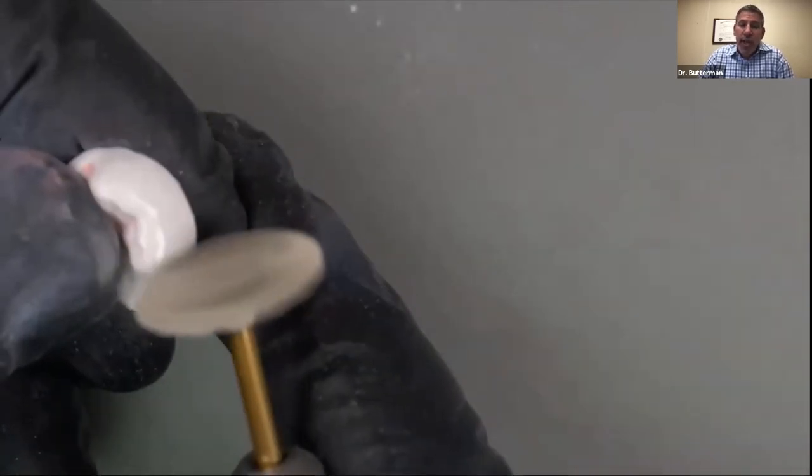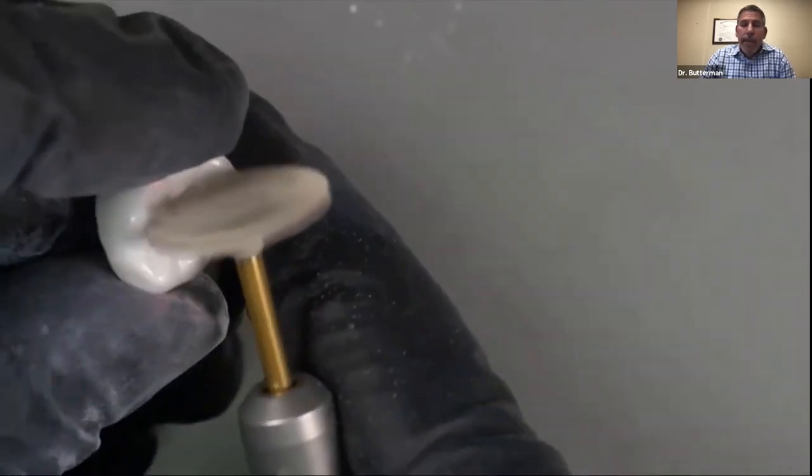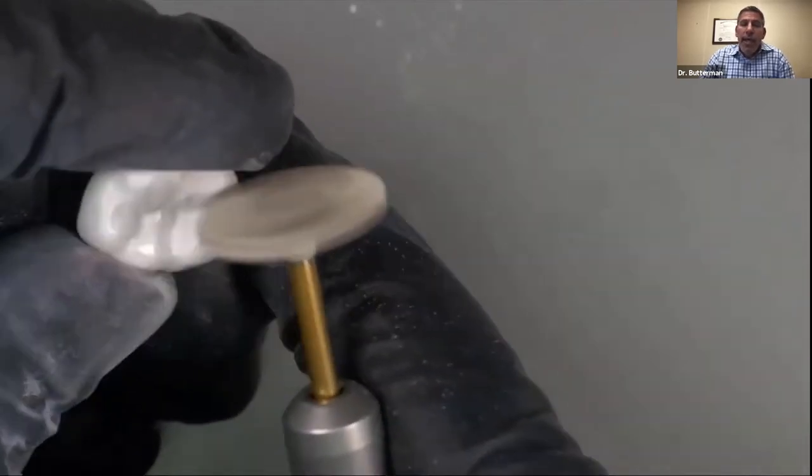We haven't even sintered it yet. This one, I will polish the contacts. I have no concern polishing the contacts at this point. And it's at this state where I'm going to put it in the oven.